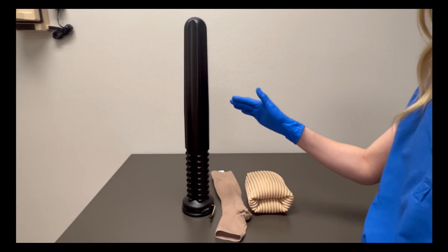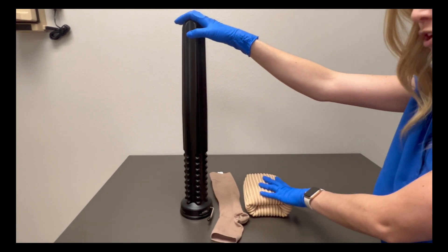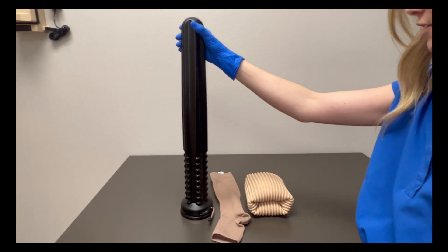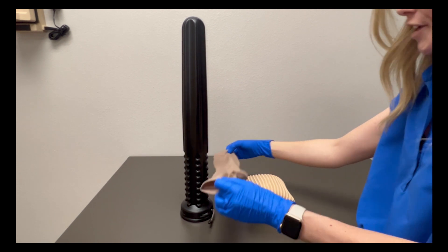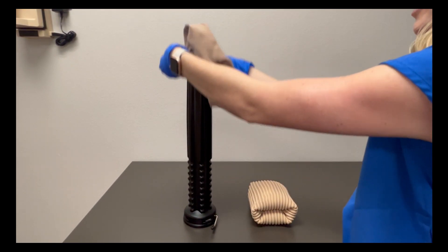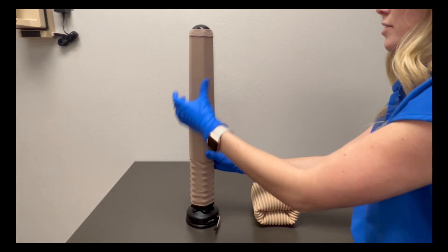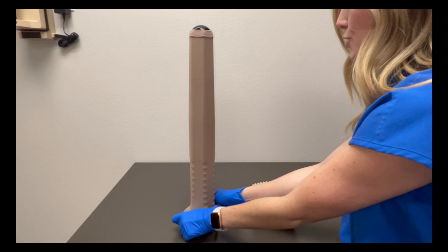Next I'm going to show you how to put your compression sock on by using the Doff n Donner. You want to make sure you have your jelly donut, compression sock, and the Doff n Donner. I'm going to take my compression sock — you want to make sure that the heel is facing away from you when you put it on. I'm going to slide it all the way down, bringing the excess material to the bottom.